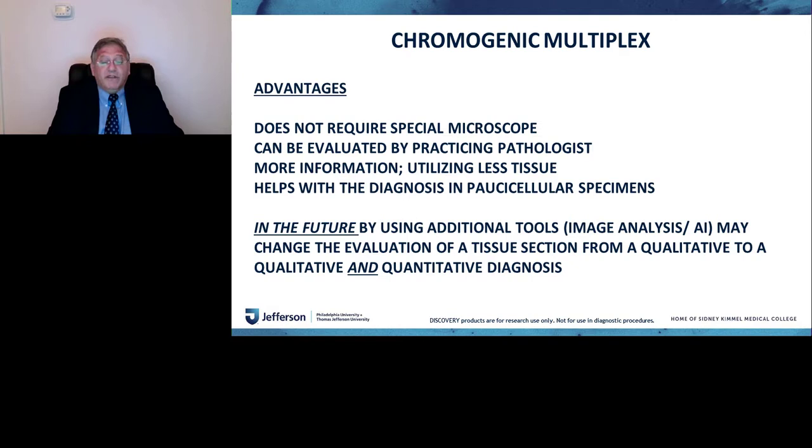We're going to have digital images coming on our computer, and as pathologists, we have to evaluate them. And here is basically where, by adding multiplexing, image analysis, and AI modules, you are going to have tremendous information coming out of the pathology department in the near future that is going to be so helpful for oncology and for treatments and everything else.